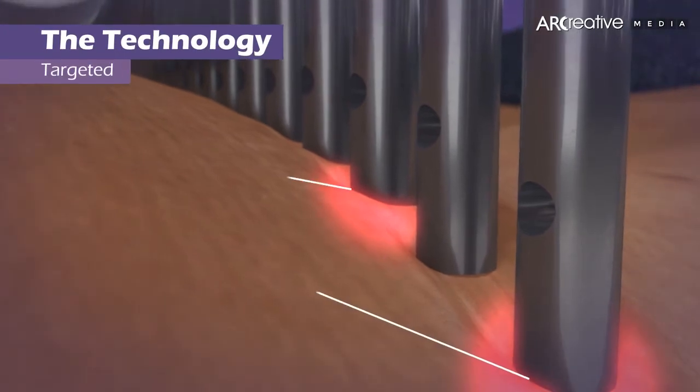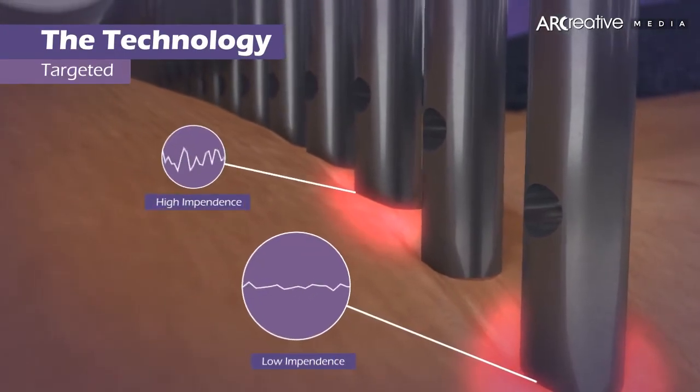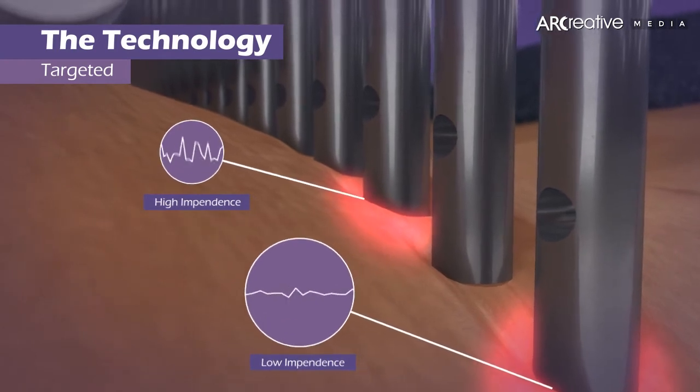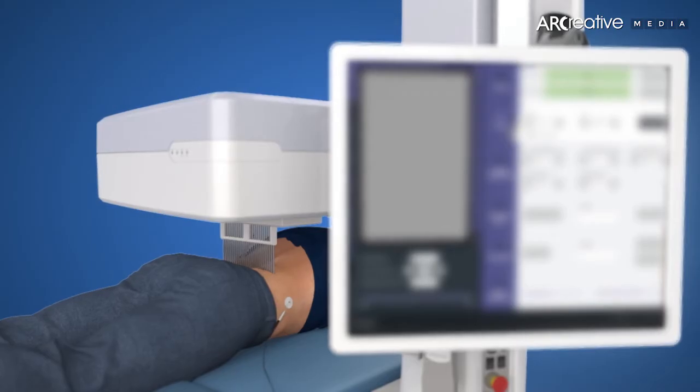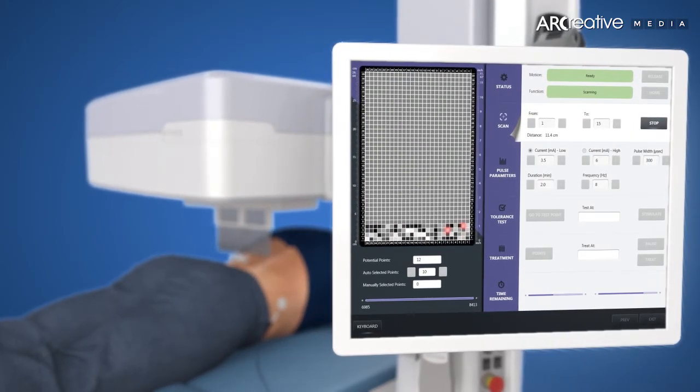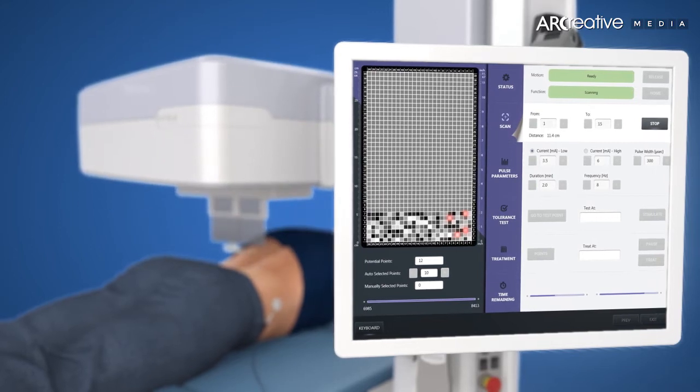Using an array of miniature probes coupled into an automatic robotic system, a two-dimensional image of skin impedance is generated. Soliv analyzes the data, identifies the active trigger points as potential locations and visualizes it on the impedance image.